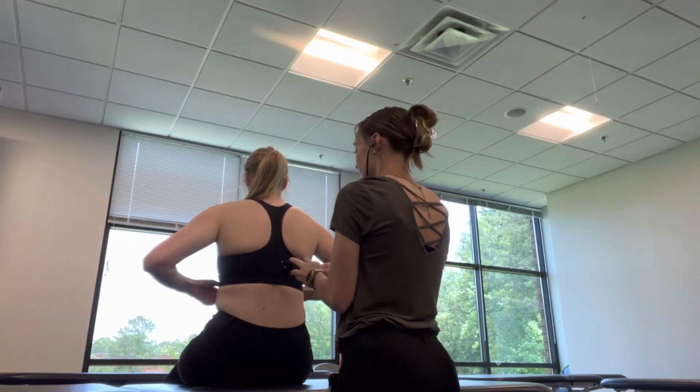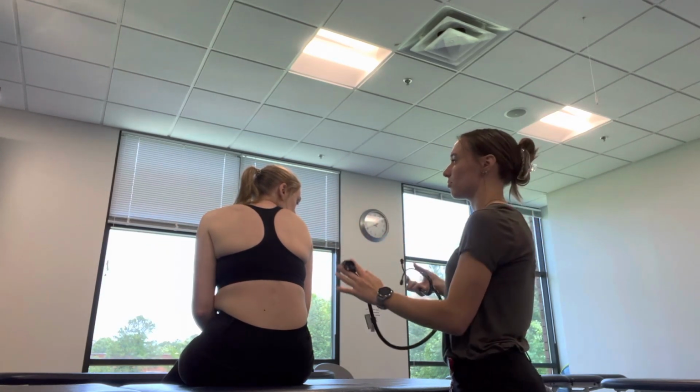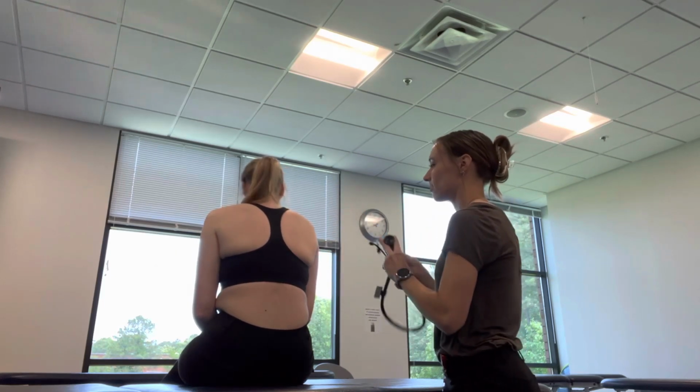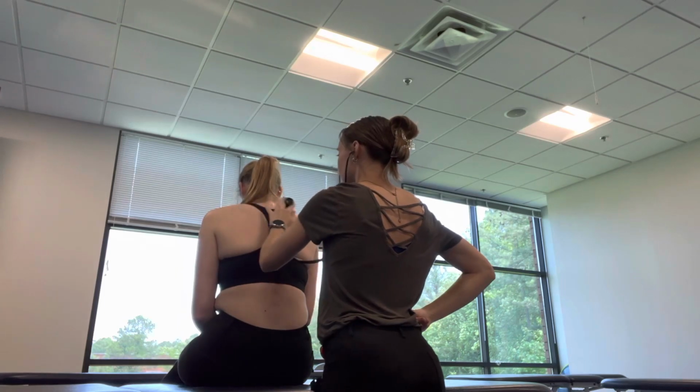And then I'm just gonna, since I've already taken her through all the breathing cycles, I'm just gonna go on your back. You gotta make that sound. So just breathe normally. Come over here.